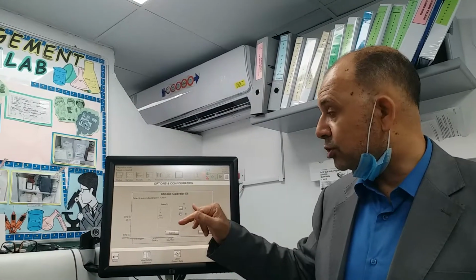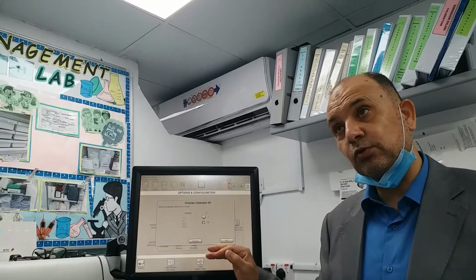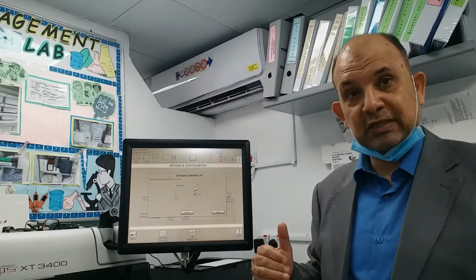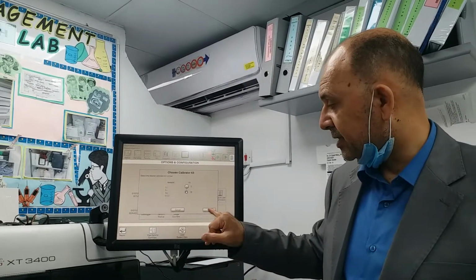If I choose 2, I cannot run 32. And the same, if I choose 32, I cannot run 2. Okay, now you know the sequence for using this one. Okay, I choose 32. Now I say next.